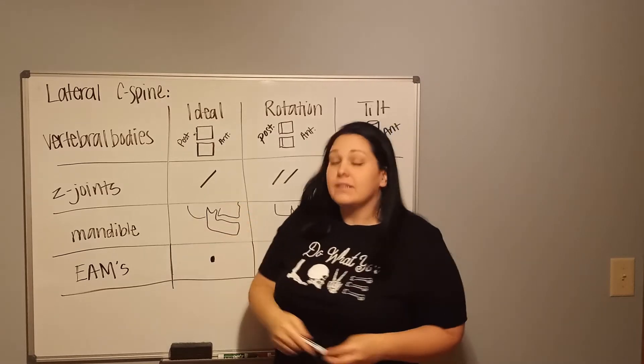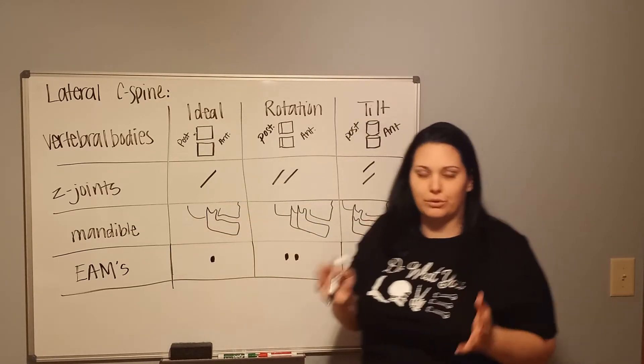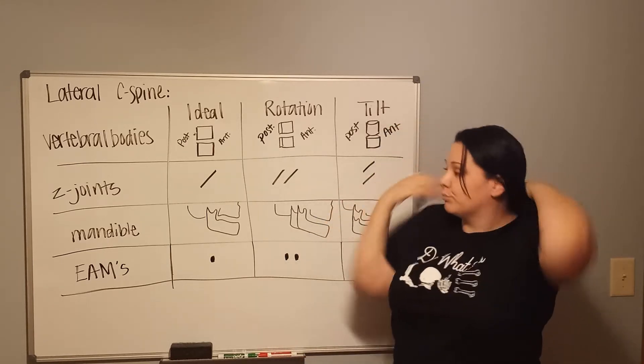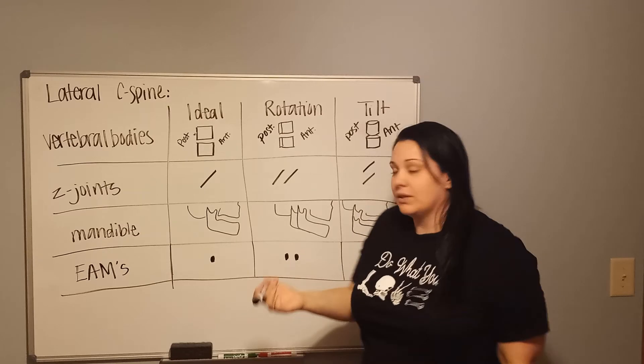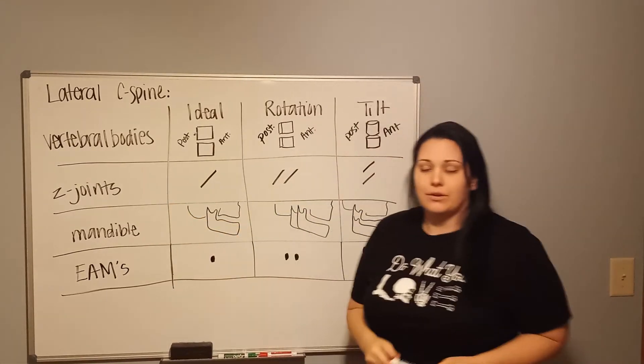Now we're going to say that the vertebral bodies you feel kind of okay with what they're looking like, but you're not totally sold on if this is a rotational problem or if it's a tilt problem. So the next thing you can look at is the Z-joints.